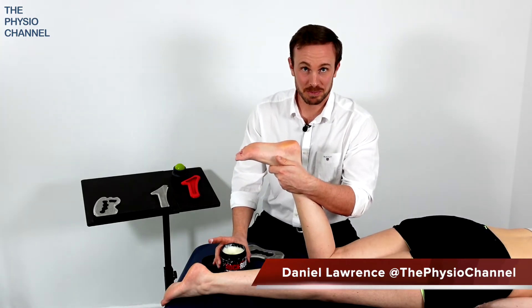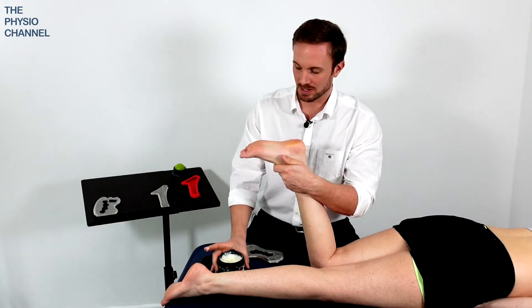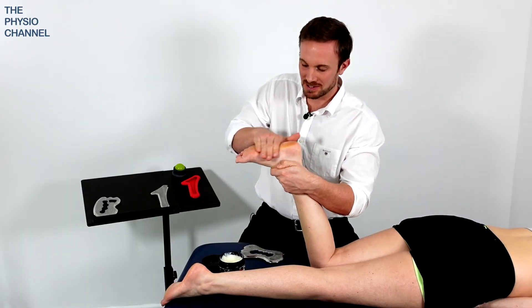It's usually a good idea to put some wax or emollient on the foot, and in this case I'm going to use some rock rub wax to rub over the foot before I start the treatment.